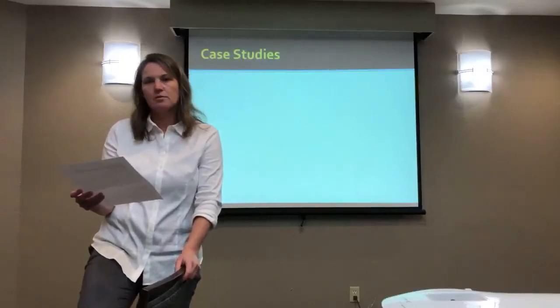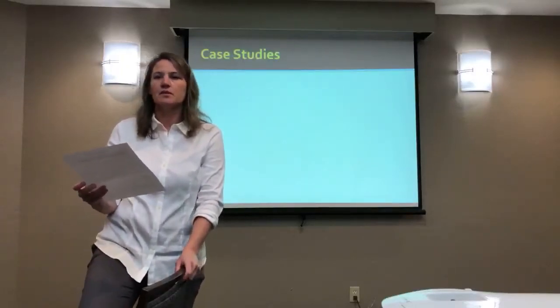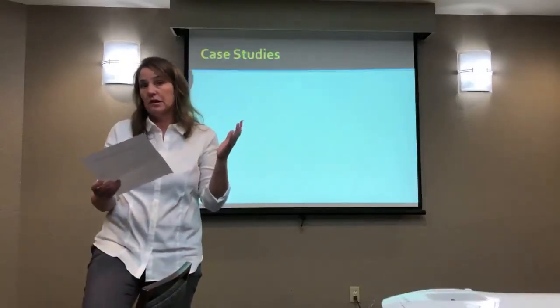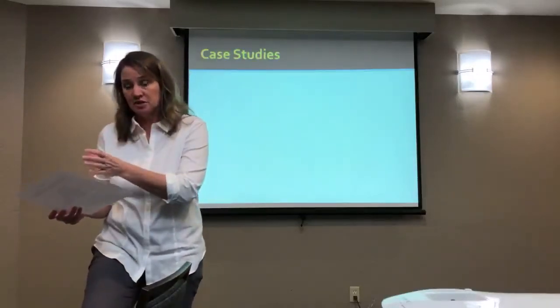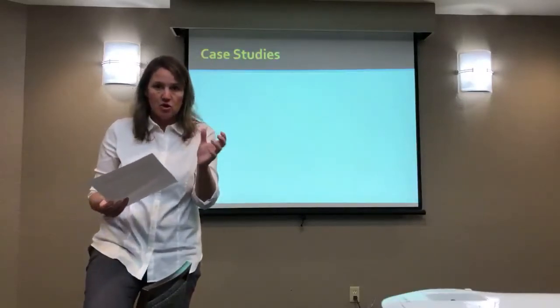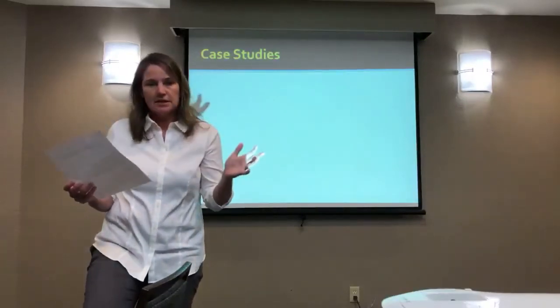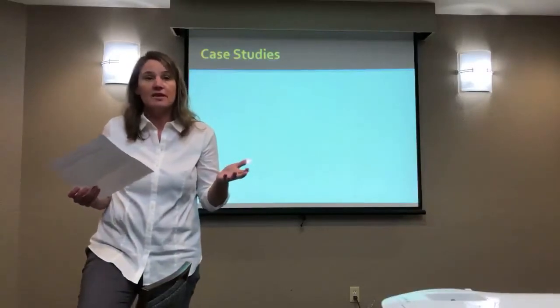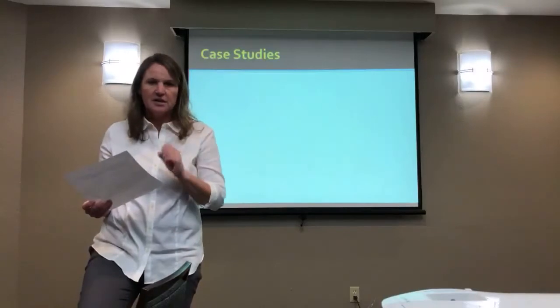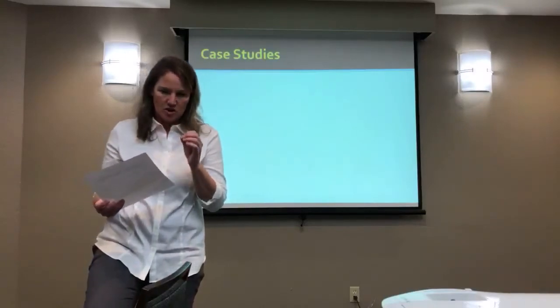I wouldn't have a problem, let's say, if you wanted to go up a little higher, if it was a person who was bigger, simply to say, well, the study I was going by, this is clearly going to be a deeper, bigger target. But is it necessary? Not necessarily. And do I have evidence why? Not really. No. It's simply going by the likelihood of me getting enough energy into this target.